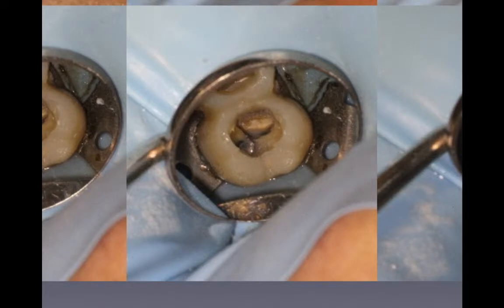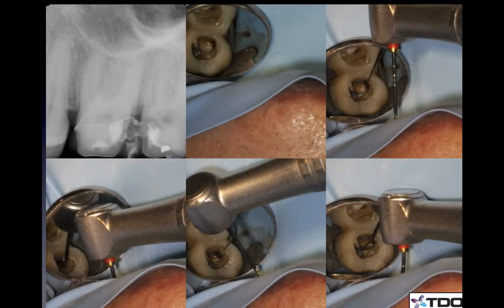A couple of things are required to do this. You need high magnification, like 7x or better. And if we're going to use rotary, it's important to have heat-treated instruments that you can bend and get into this area. We're using the mesial decay here and we really haven't unroofed too much of the distal portion of this tooth. It's hard to get our instruments in there, so we need to pre-bend them. This nickel-titanium heat-treated instrument is bent so it will go into the distal.